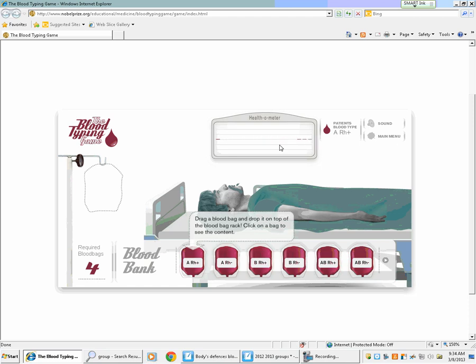On your paper, it says conclusion. What is this patient's blood type? Fill in this patient's blood type. What is the patient's blood type? Okay, right now, on your own, I want you to fill in what blood types this patient can use to be transfused into them. So it says what blood types can be used for the transfusion. Right now, write that down. You don't have to put the RH. You can actually just put A positive, O negative, O positive. That's fine.